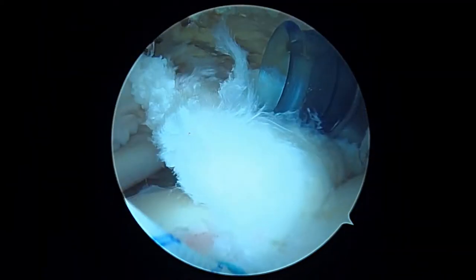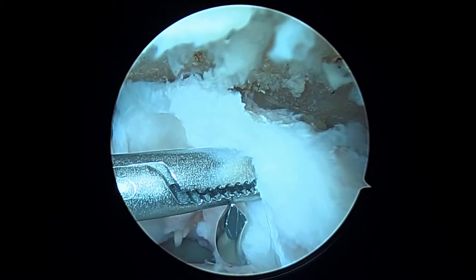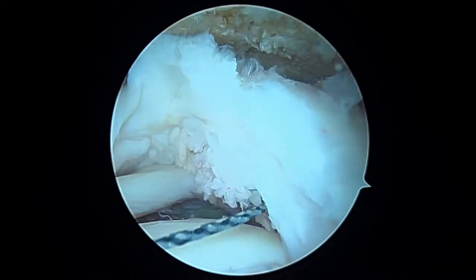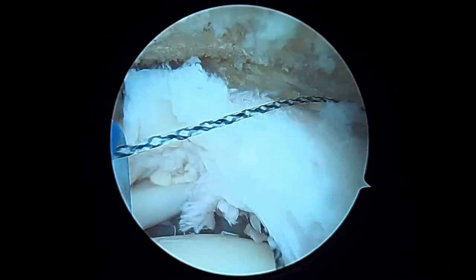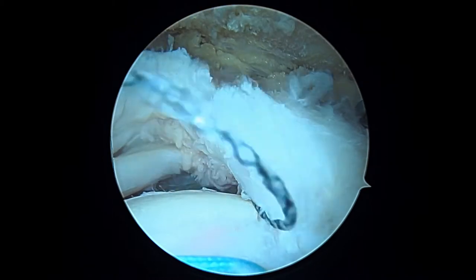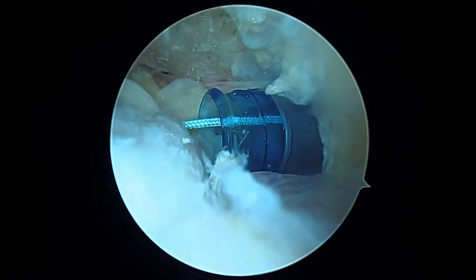Now we're going to use a slightly different angled suture hook — what we call a 'turn to the left.' Here's our second bite; you can see how we're getting all the way underneath, and now we're going to feed that through. Just like before, we'll load that, pull tight on the relay and load it. As we pull back, you'll see that bring the suture through.